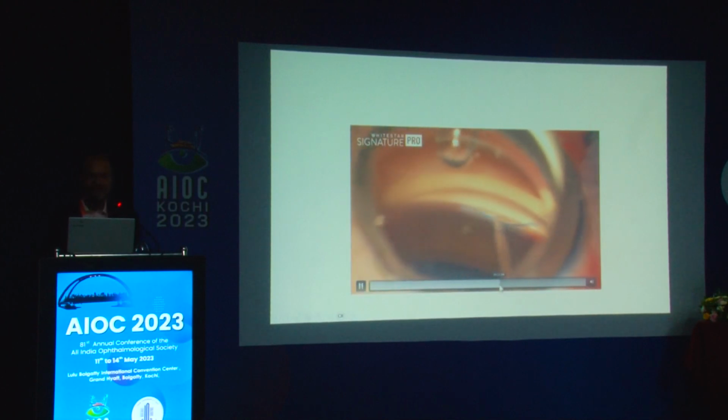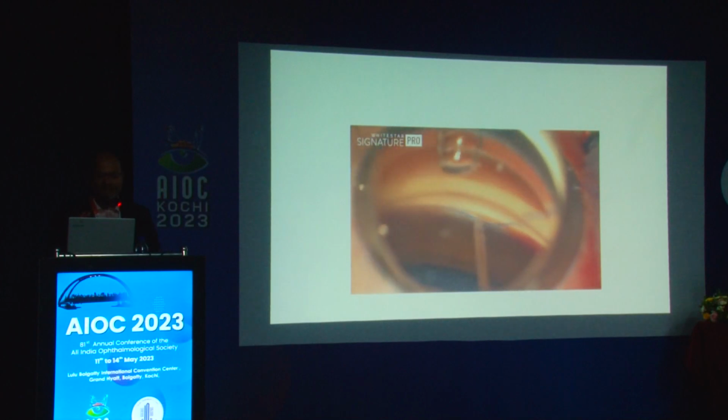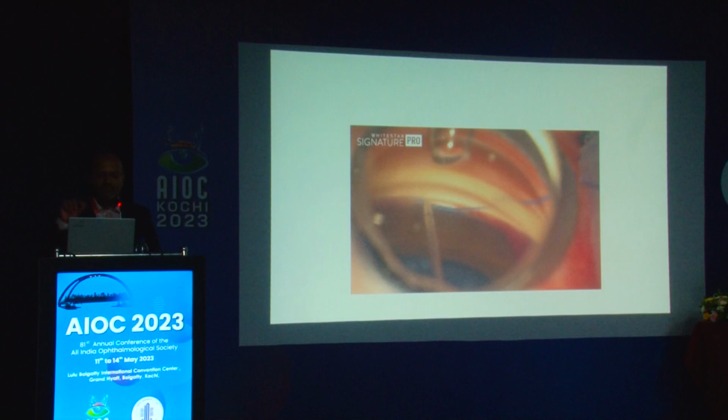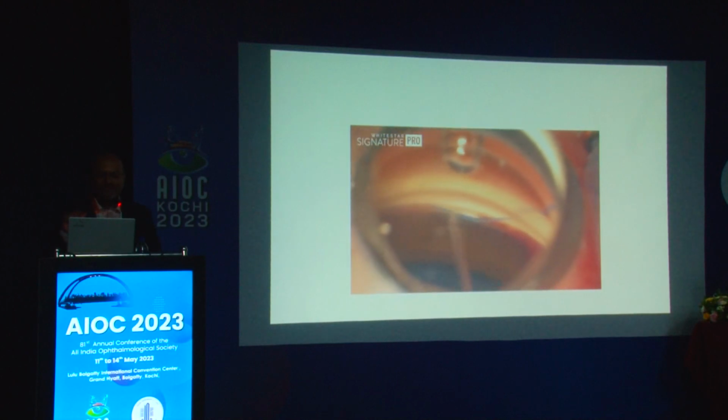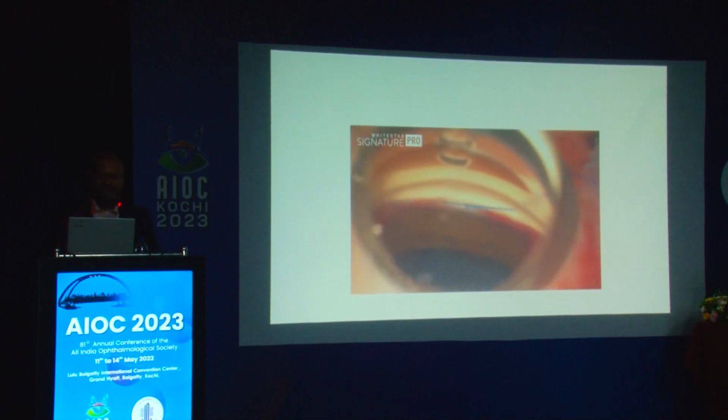And once you push it, you need about 19 to 24 pushes. So people recommend not to use the stroke, but rather to maybe make it a kink. But sometimes the kink we are not able to see or visualize. So I rather prefer to use the number of strokes. About 19 to 23, 24 strokes are required.